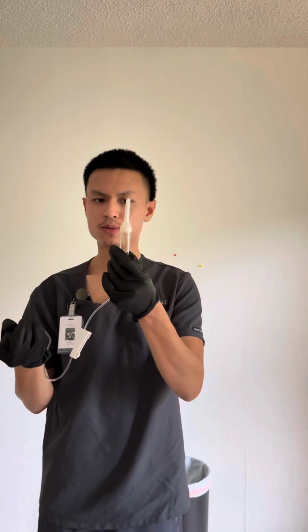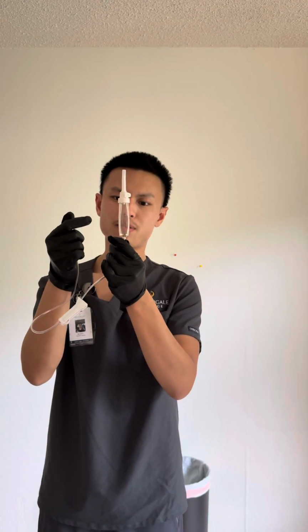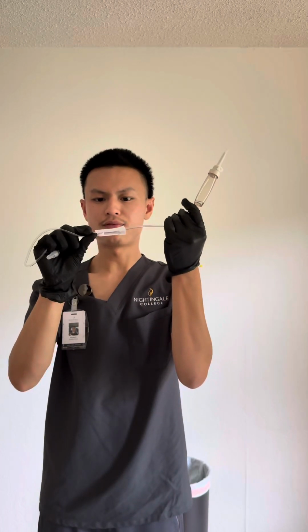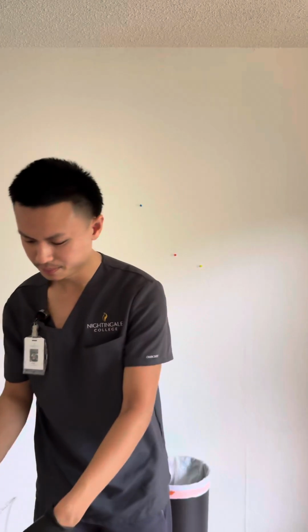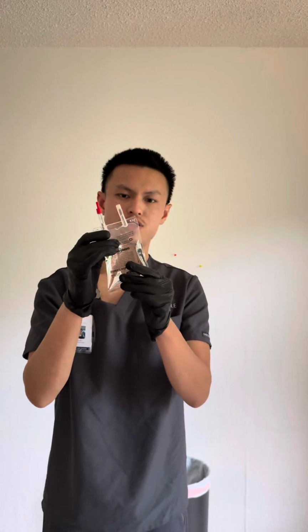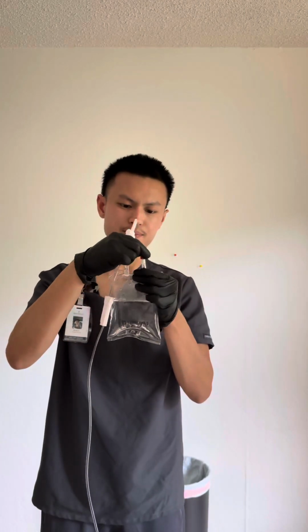I have my secondary tubing, same thing. I have the spike with the cap on, the drip chamber, which I will fill halfway with the medication and count the drips that flow into the chamber. I have the roller clamp that is adjustable, and then I have my adapter, which will connect to the Y site of the primary tubing. And then I have my fluid and medication.